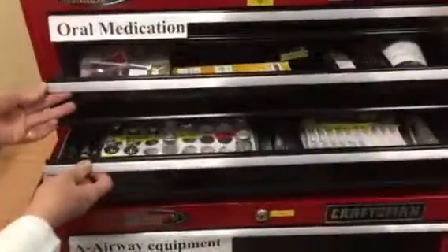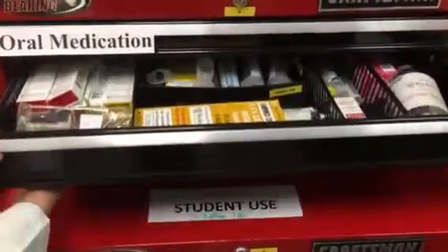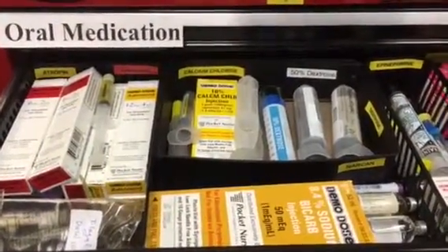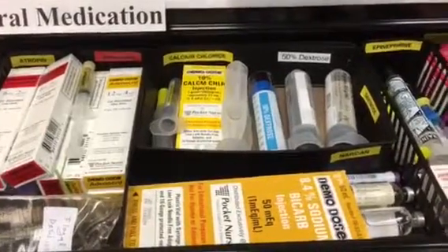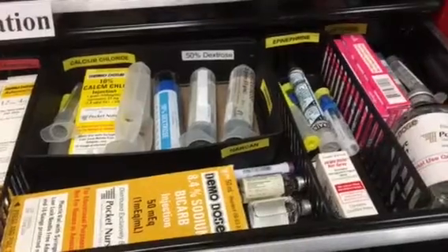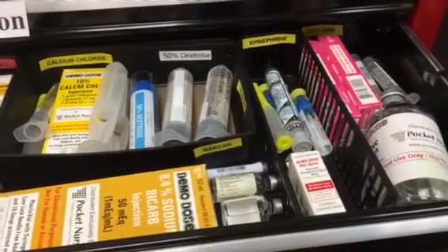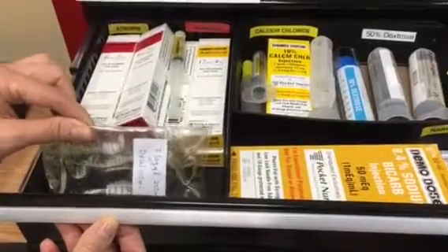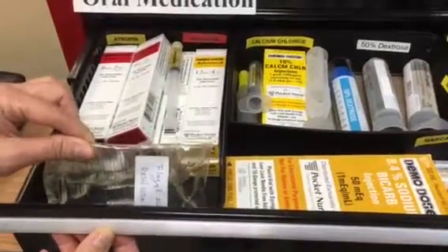So we have two drawers for the IV meds. The top one usually is for critical medication. If you have a patient who needs a code, then all the medication is here. We would like to emphasize that in this drawer we put your antibiotic IV piggybacks on your left side. This is very important for you to know.